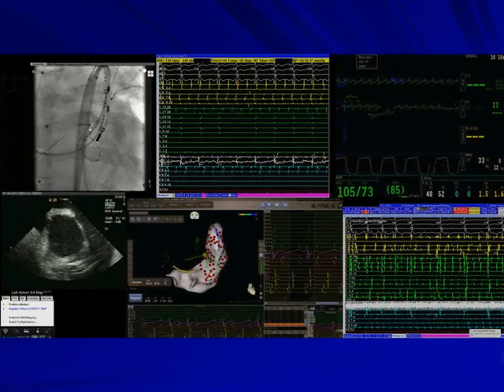So we have here, and I don't know how well you can see, a circular catheter here. There is an ablation catheter. We don't recognize this one. It was actually a stereotactic catheter. We thought we didn't have a whole lot of manual control of the tip of the catheter with such an odd and circuitous way of going to that structure.